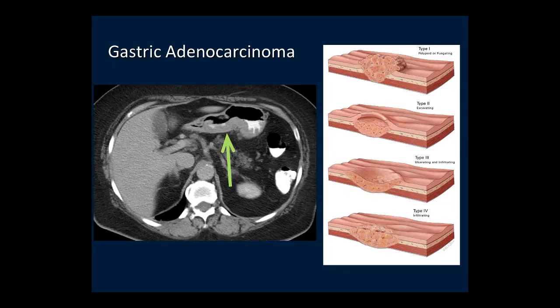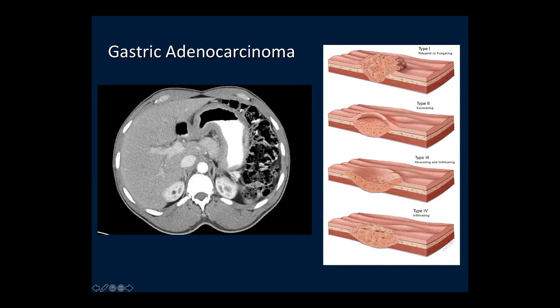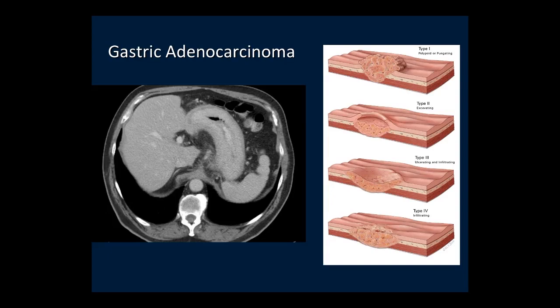The ulcerating and infiltrating form has an infiltrating component that thickens the gastric wall, with ulceration along the luminal surface. The infiltrating form focally or diffusely infiltrates the gastric wall, thickening it and replacing the normal rugal fold pattern. These can have normal gastric distension or may narrow the stomach due to fibrotic reaction as the tumor infiltrates, producing linitis plastica. This is a nice example of linitis plastica with narrowing of the gastric lumen, thickening of the gastric wall, and loss of the normal rugal fold pattern. Small perigastric nodes in the perigastric fat accompany this tumor.